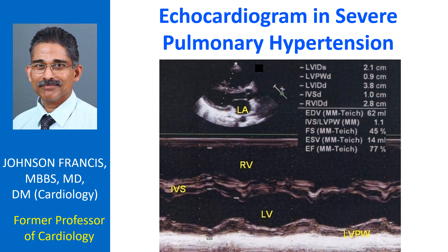When the right ventricle is dilated due to volume overload, as in atrial septal defect, the septal motion becomes paradoxical — moving towards the right ventricular free wall in systole. Here, the septal motion is towards the left ventricle in systole, suggesting that right ventricular enlargement is due to pressure overload rather than volume overload. Estimation of ejection fraction by M-mode becomes erroneous if paradoxical septal motion is present.